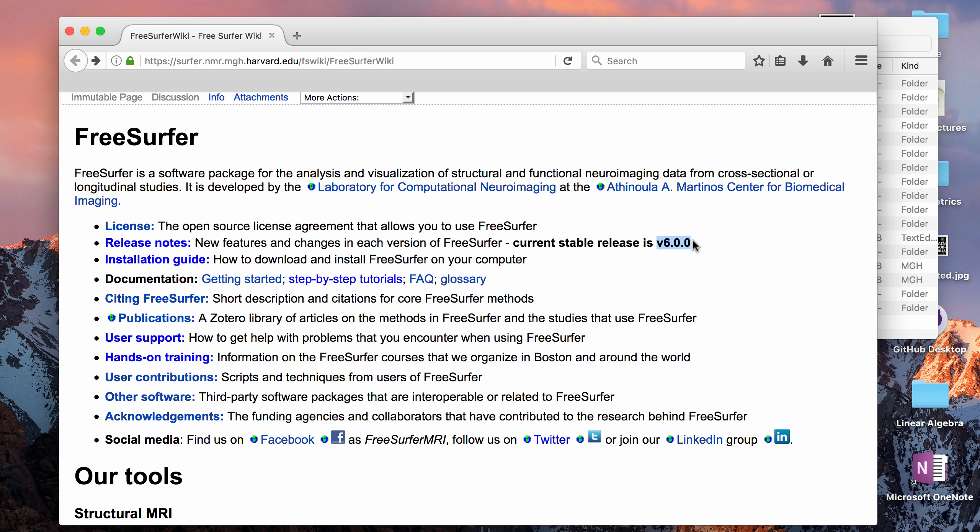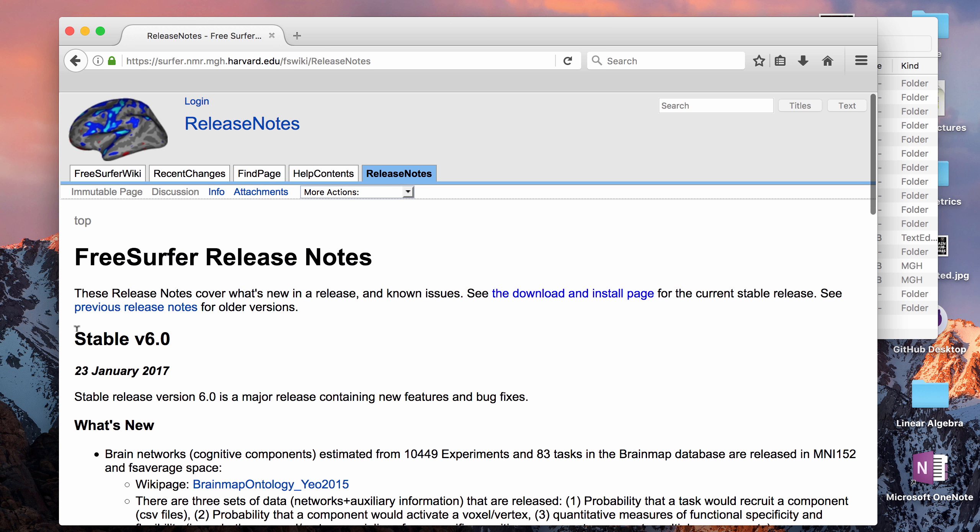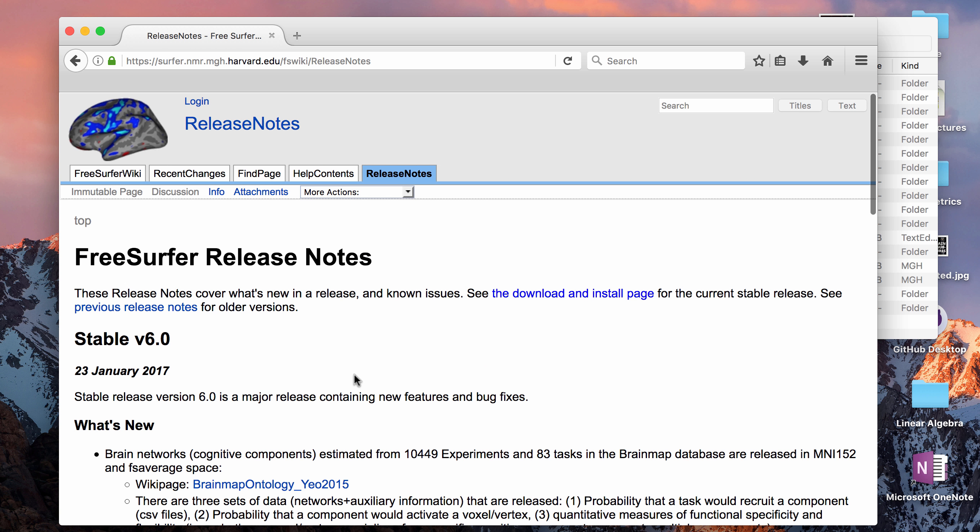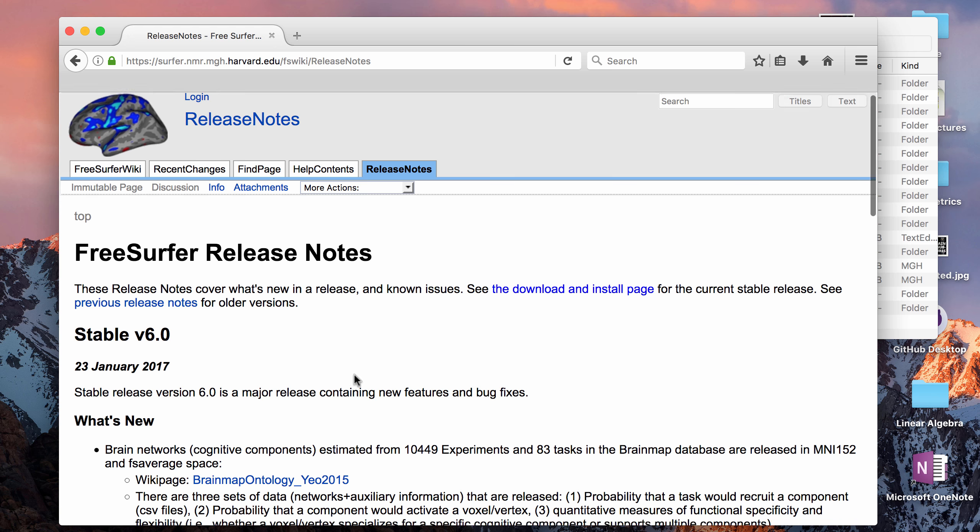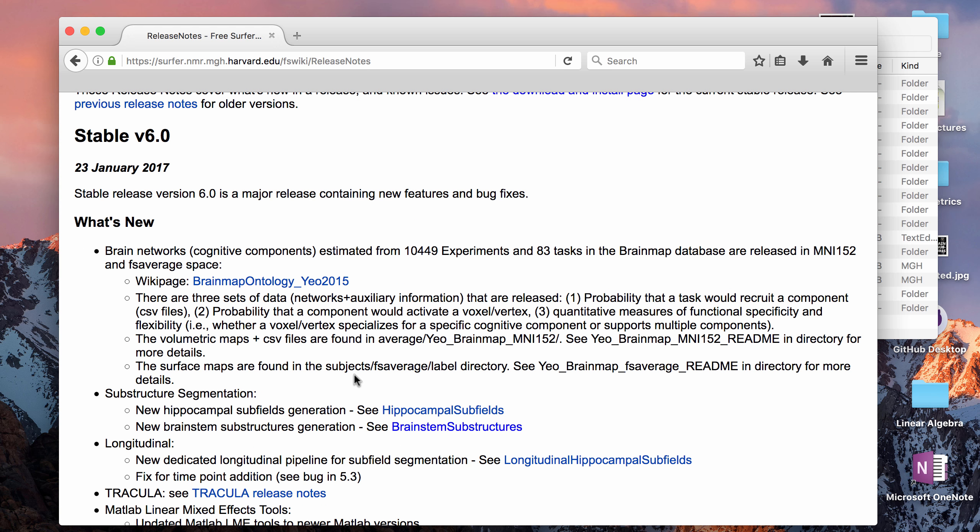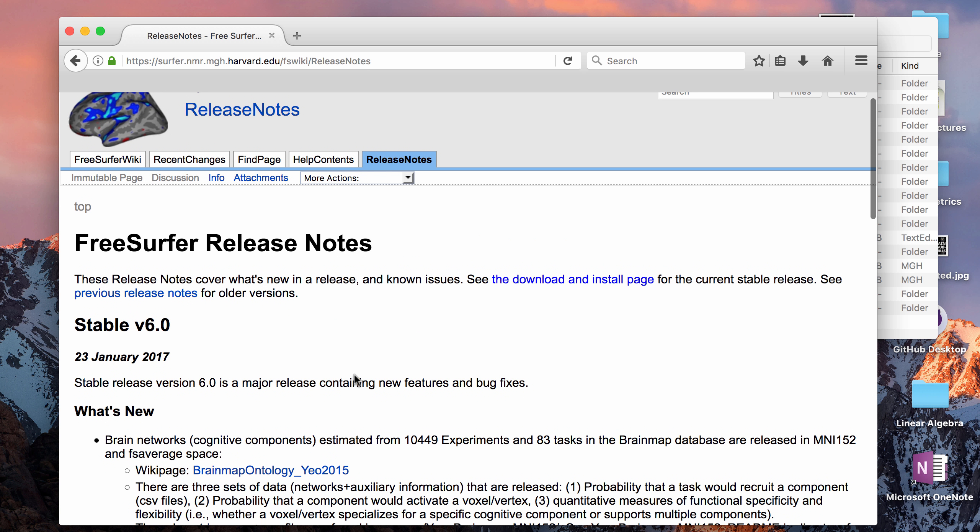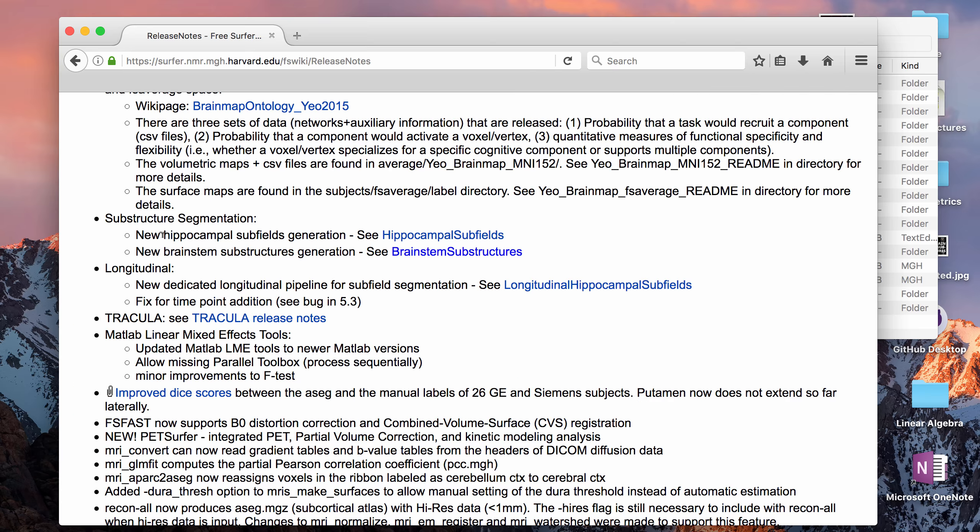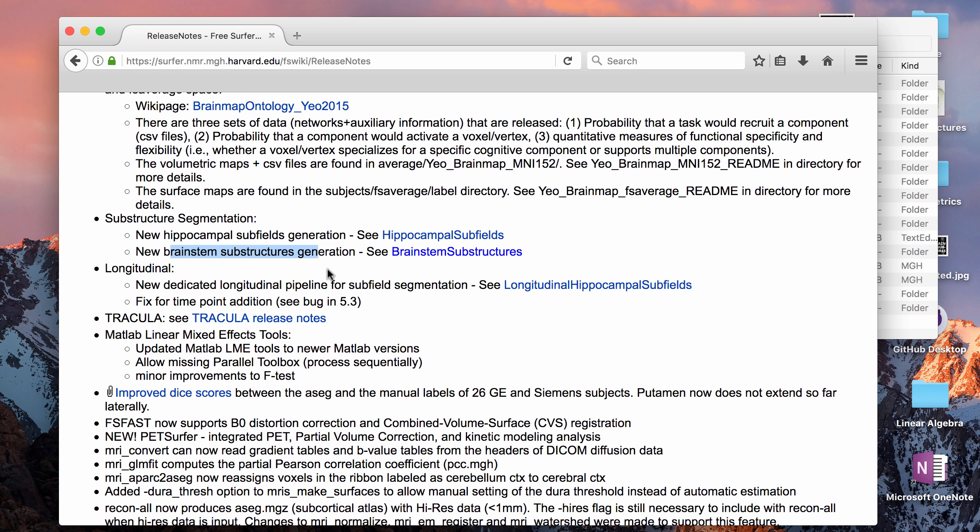This was released last month at the end of January 2017, and for this tutorial we're going to use version 6.0. The stable release before was 5.3, and if you want to follow along you're going to have to download 6.0. When you open your terminal window it should say 6.0 and not 5.3. If you look at the release notes, this 6.0 version has hippocampal subfield generation which was updated from 5.3, and it also has a new capability of brainstem substructures generation.